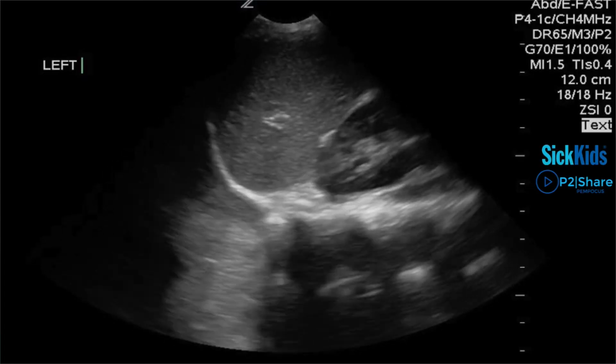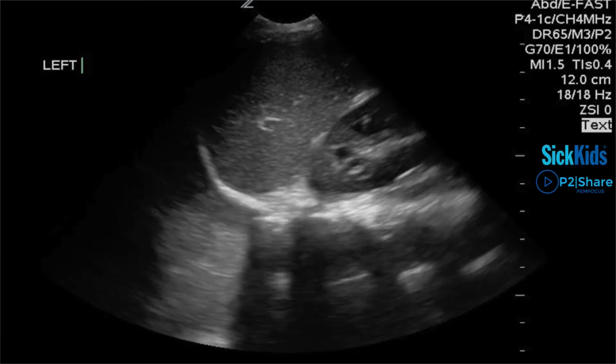So if there's normal, well-aerated lung above the diaphragm, the ultrasound machine interprets the sound waves as traveling straight. Because it's a curved diaphragm, what happens is you get a mirror image. This is where you're going to see liver or spleen tissue appearing both above and below the diaphragm.